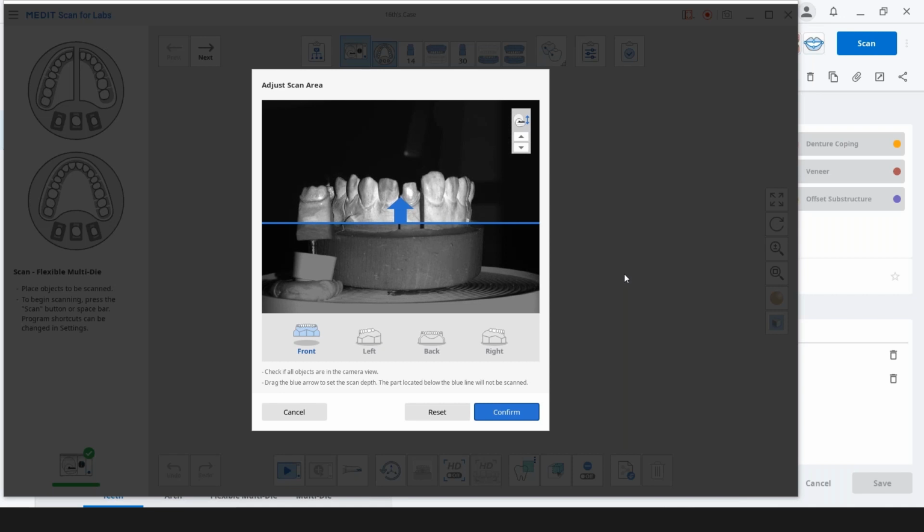Just think about yourself. If I come to you and shine a flashlight in your eyes, it just doesn't work for being able to pick up what you're looking at. You can see it's a flashlight, but you really can't see the metal around the light. You're just seeing a bright light. So maybe some materials are more reflective, which is going to affect the detailing on the model later. Absolutely, yep. Okay, got it.